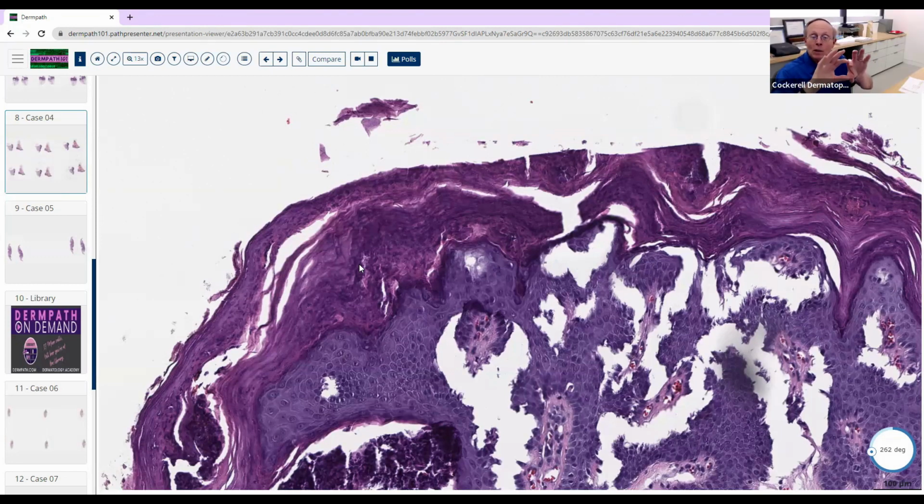And even if it's relatively broad parakeratosis, you'll still see neutrophils in there, and it tends to be more in mounds rather than being a diffuse confluent parakeratosis with neutrophils like you see in pityriasis lichenoides, for example. So you can tell a lot just by the cornified layer.